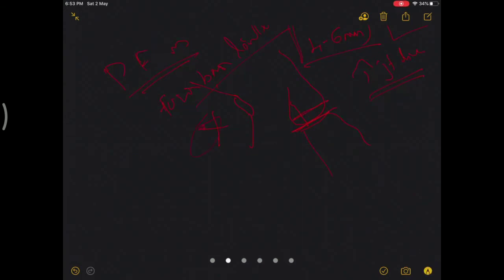Since we are taking the cruciates out of the box, these two still try to act with each other, and you have to keep the strain of these two as the preoperative strain, otherwise they fail. And so by elevating the joint line, you are going to change the mechanics of the patellofemoral joint. So there are some issues with the patellofemoral mechanics, and that may lead to patellofemoral arthritis.